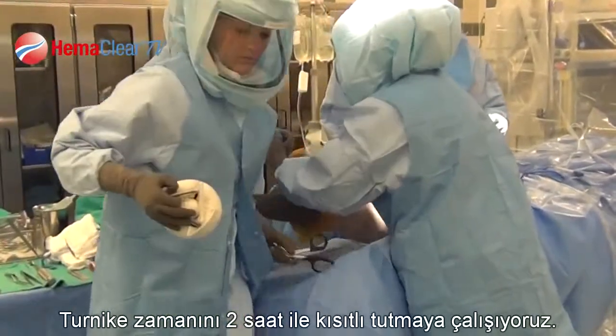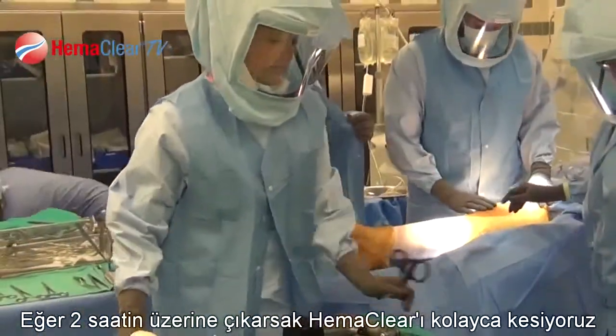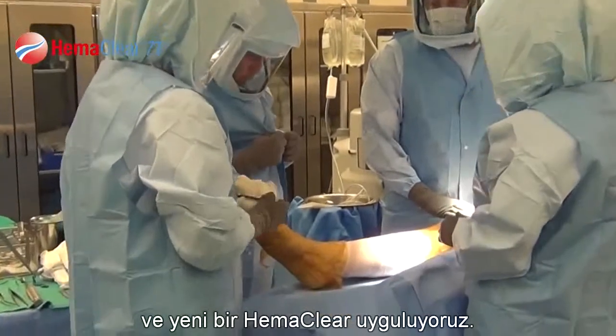We try and keep our tourniquet times under two hours. If we do go over two hours, it's very easy — we just cut the HemaClear and then apply another HemaClear.